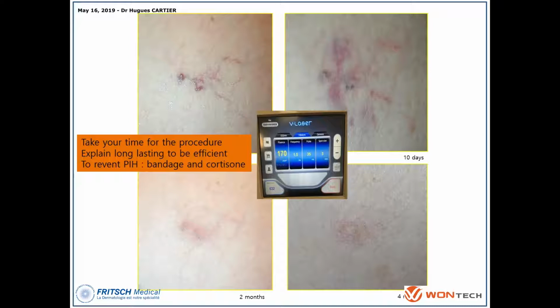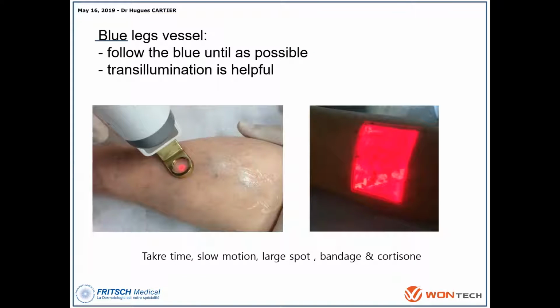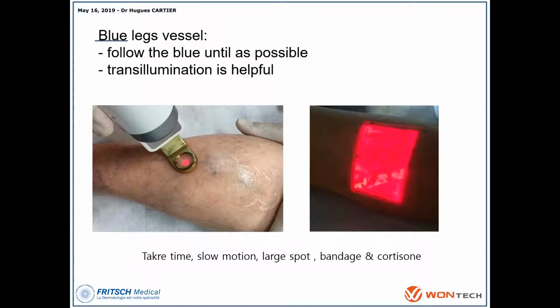Maybe you have to explain to your patients that you have to wait maybe 6 weeks, 2 months, 3 months. Don't be so afraid by the time of the delay to reduce the vessel. It takes more time than for the face. So another possibility, another video for large vessel is very important.